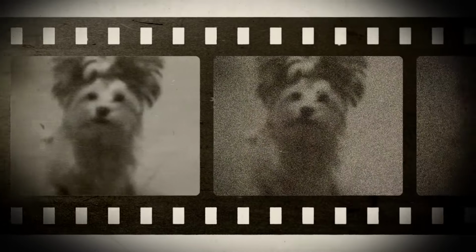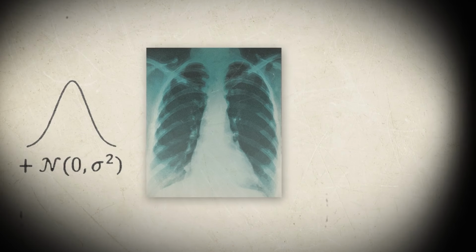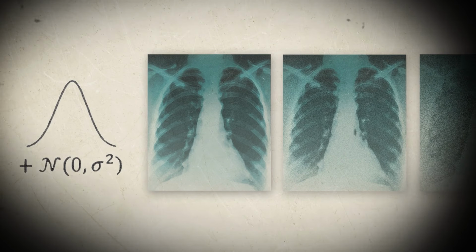We'll keep progressively adding more and more noise. We'll get to an image that's noise only. We can start off with some random noise distribution, and we can run our denoising model, which will go step by step back, but instead of using dogs, we'll actually be using chest x-rays as we did. We also use the radiology report information to actually guide how this denoising process would work.